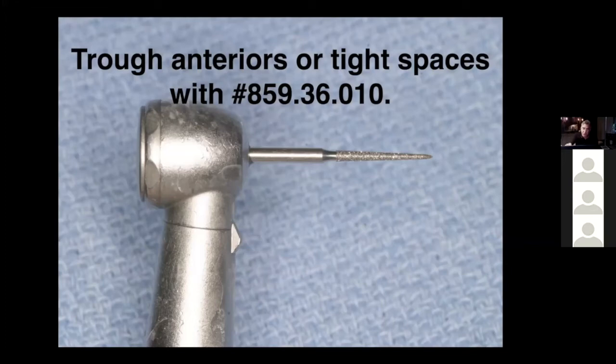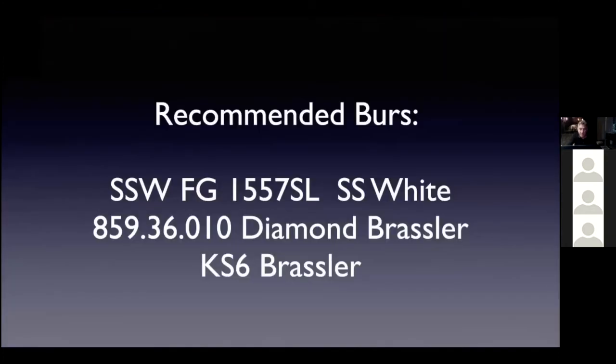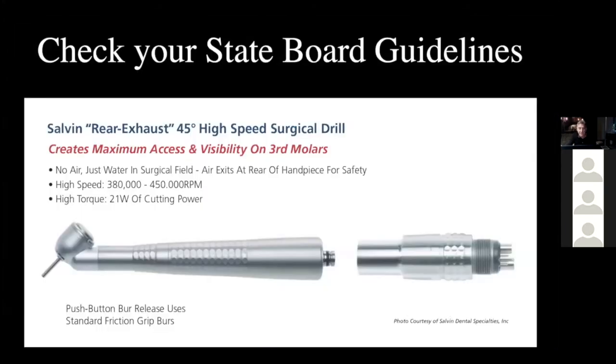In that space you created, you're going to put your elevators, and then you're always going to turn and put apical and turning away from the buccal wall type of pressure. This burr you're going to use in posterior areas, where it's a workhorse. The diamonds are very expensive, but you need them. I think they're at least $10. And you could use one in one surgery, or you could use 4. So they're the burrs. Again, I can't give them to you enough.